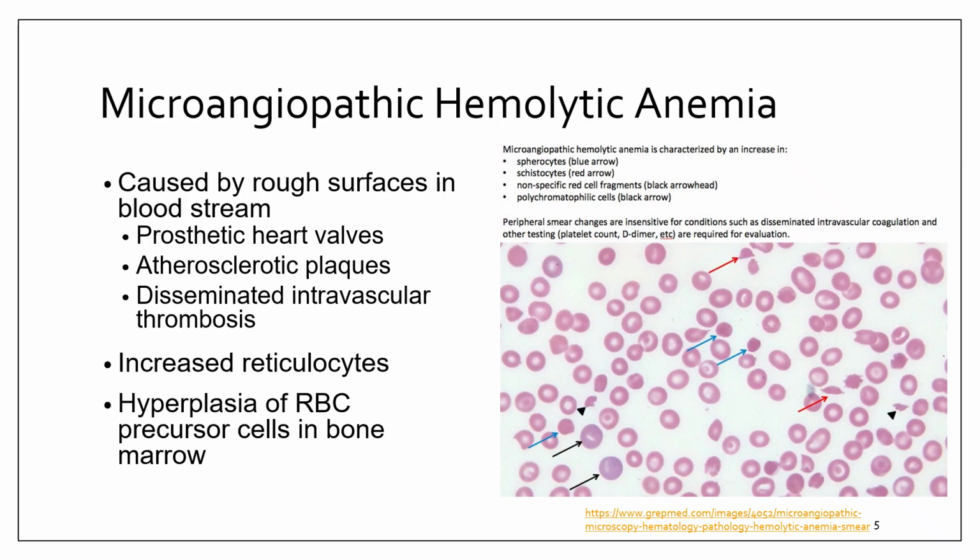A fun but useful knowledge is that schistocytes are one of the few red blood cell morphologies that should immediately raise concern when seen in significant numbers. Even a small increase can be clinically meaningful. They're not subtle, and they're never normal. Microangiopathic hemolytic anemia is caused by mechanical destruction, occurs within small blood vessels, produces red blood cell fragments, and triggers strong bone marrow compensation. The red cells themselves are normal, the bloodstream is not.